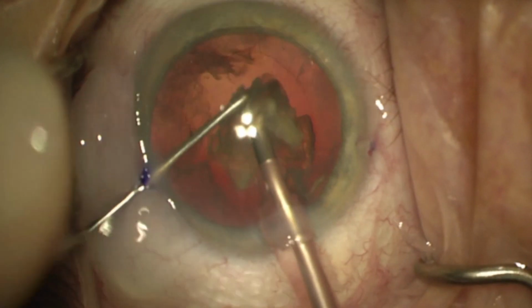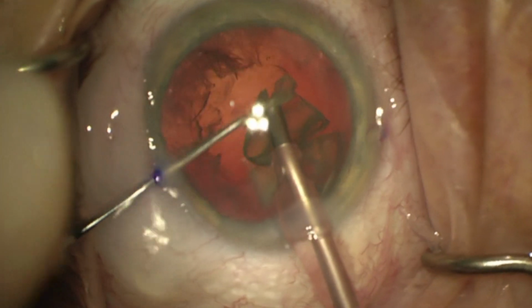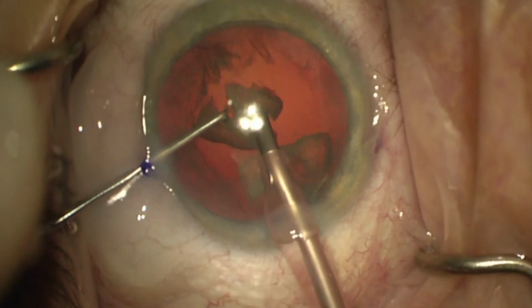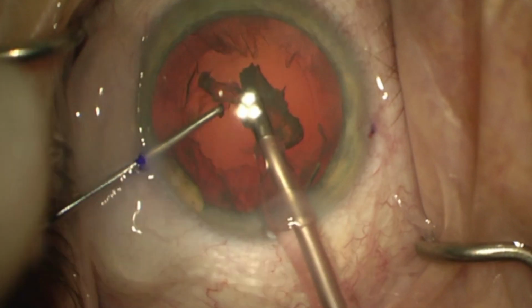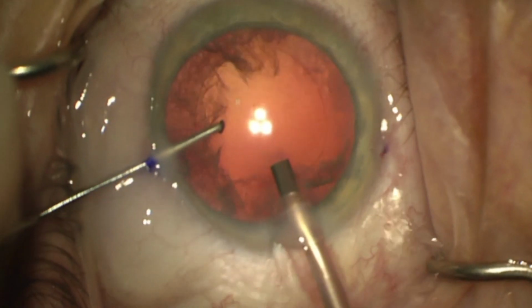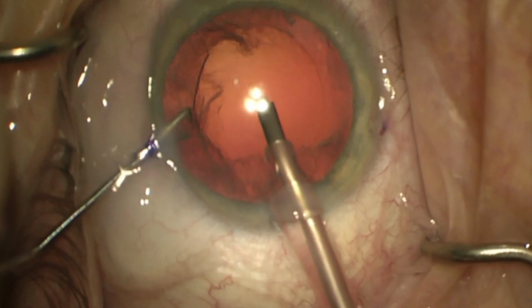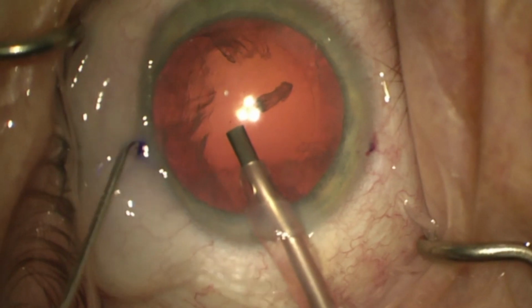You want to see things moving, so if the quadrants are not moving, then you can help that with the chopper. Also, whenever you have full occlusion and nothing is happening, then you put your foot down and use more ultrasound, and that's what I usually tell the residents. Full occlusion, nothing happens, then you need ultrasound. And that's here the end of the nucleus removal.